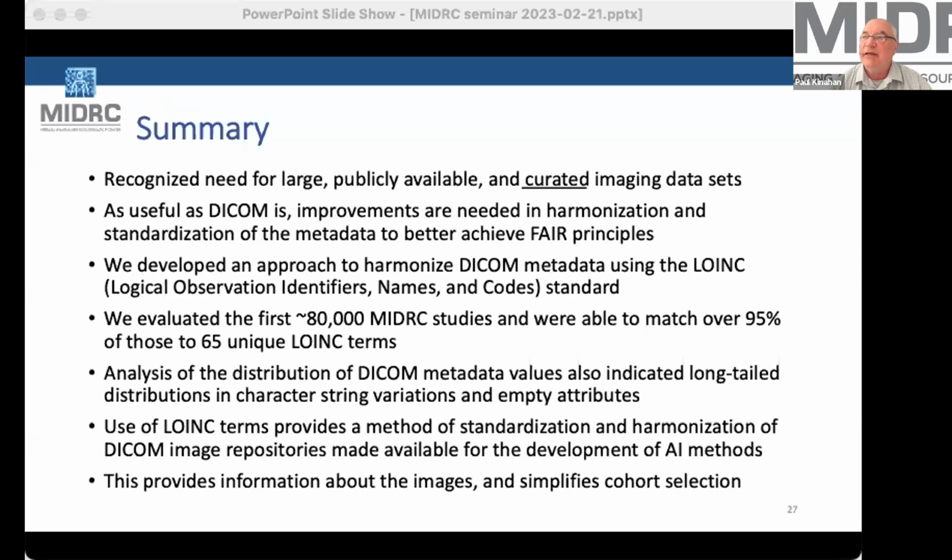Perhaps amusingly, the current LOINC system description for unidentified body regions is XXX, the three letters. And so we decided we probably shouldn't use that. So we created a new term just called unspecified. So those are kind of our catch-all.